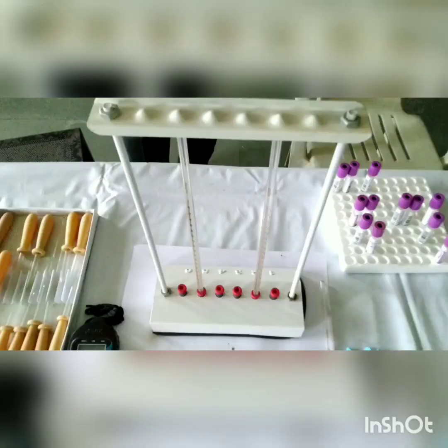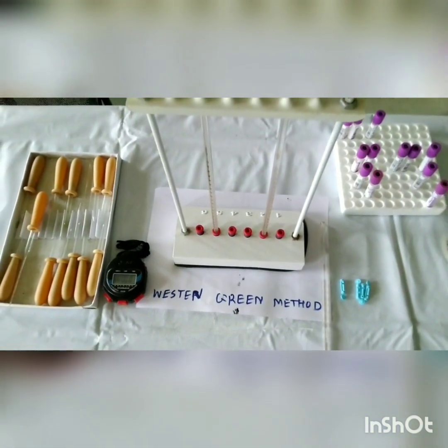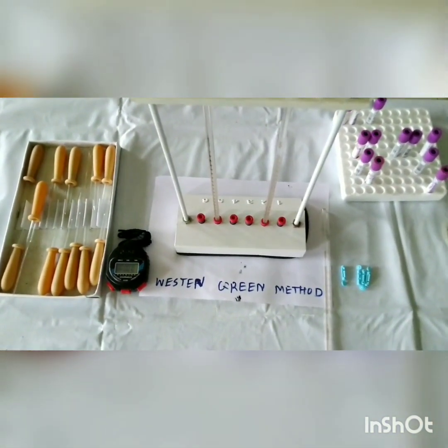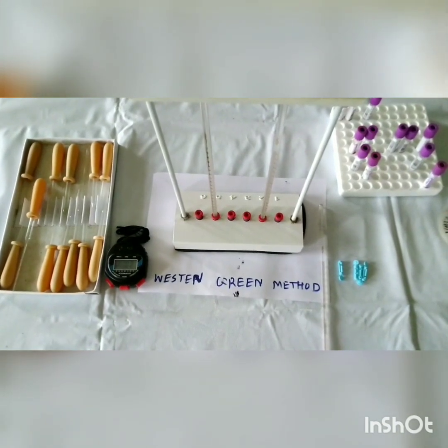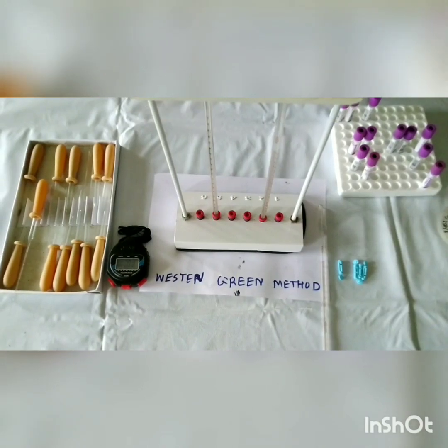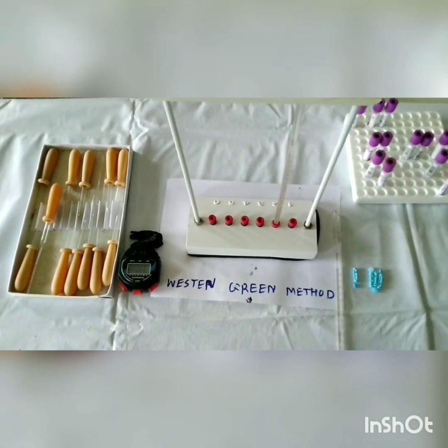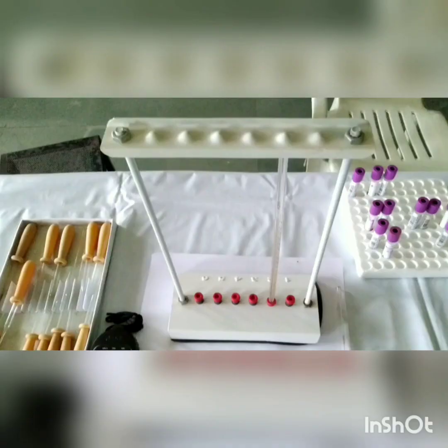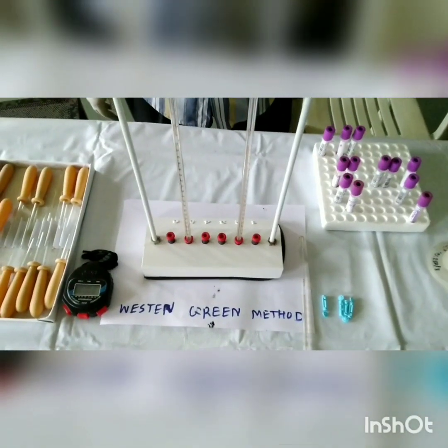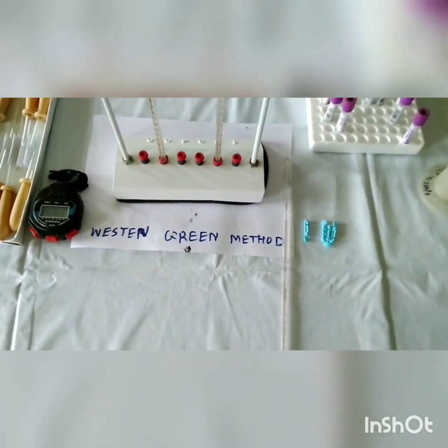Determination of erythrocyte sedimentation rate. Principle: erythrocytes remain uniformly suspended in the plasma of circulating blood, but when blood is taken out of the body, mixed with an anticoagulant and kept in a vertical tube, due to their higher specific gravity than plasma, erythrocytes sediment gradually toward the bottom of the vertical tube. The rate at which the erythrocytes sediment is then recorded in millimeters at the end of 1 hour. This is the erythrocyte sedimentation rate.